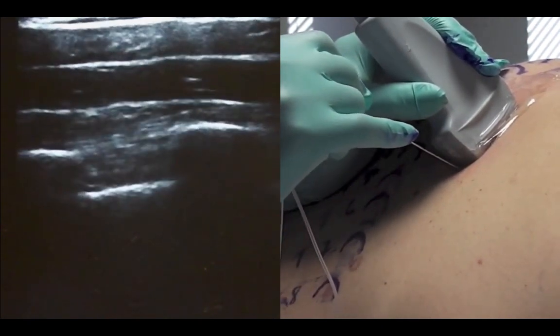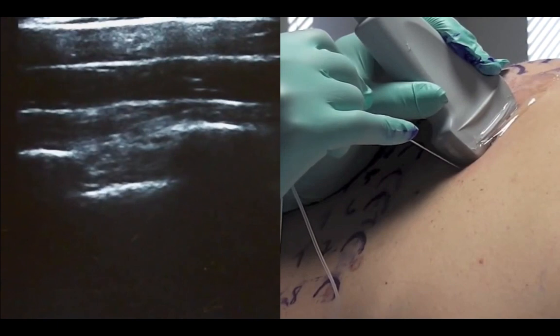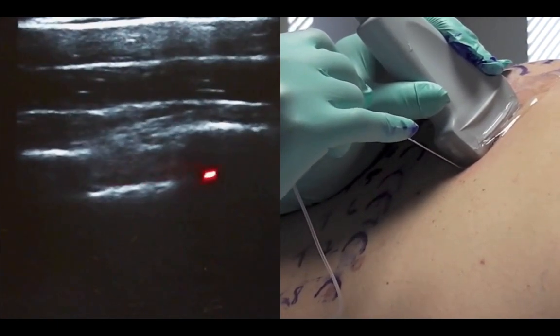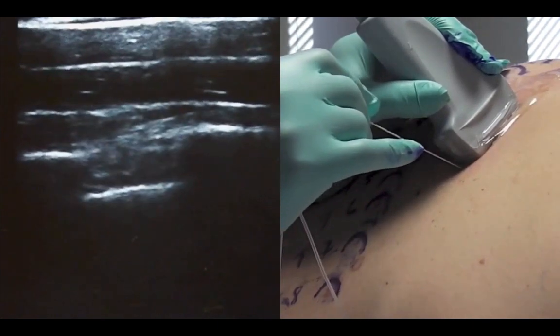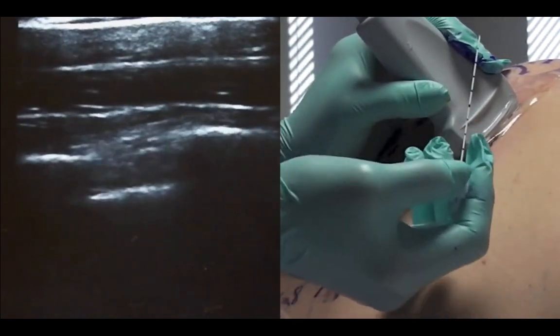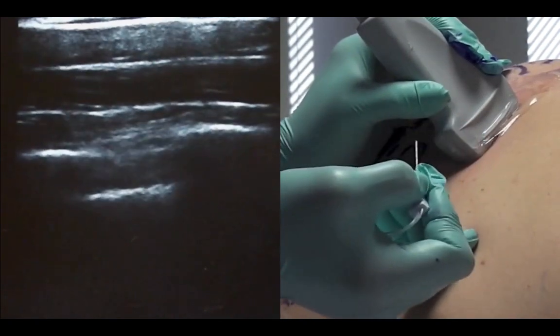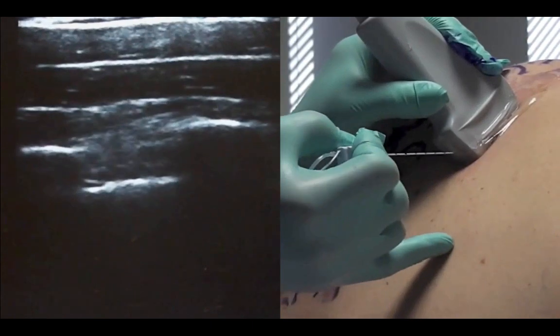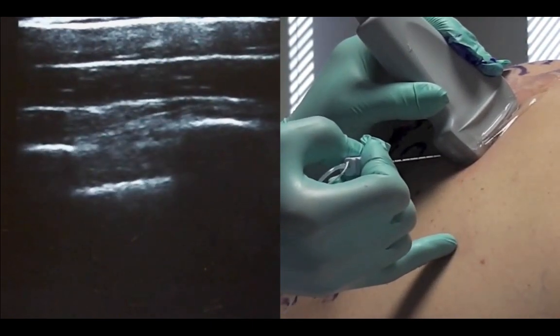Typically, I can look at the screen right here and tell you that I would expect the paravertebral space to be at about 4 centimeters. If I got to 5 or 6 centimeters with this needle, I'd start to get concerned that the needle is not where I thought it was and could be violating the pleura. The incidence of pneumothorax with this block is less than 1%, so it is relatively very safe, but certainly pneumothorax is always a potential complication.